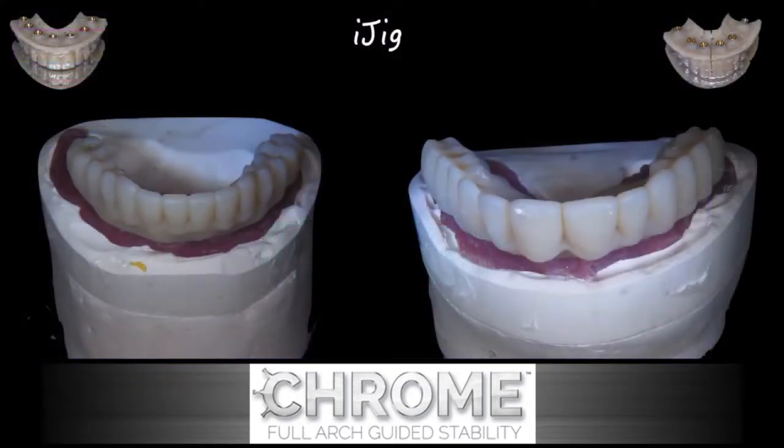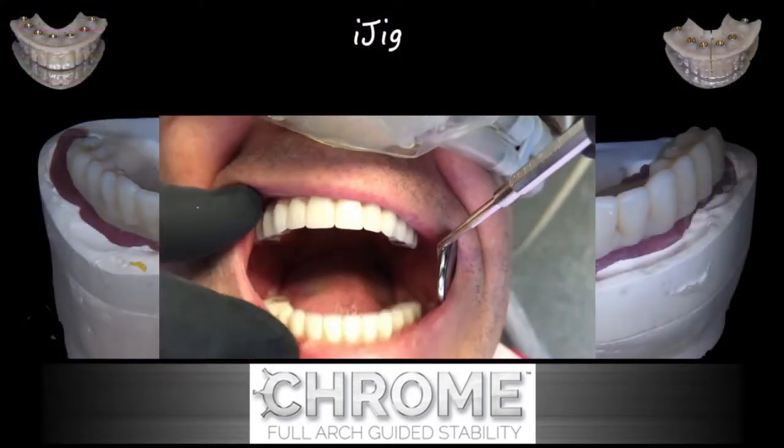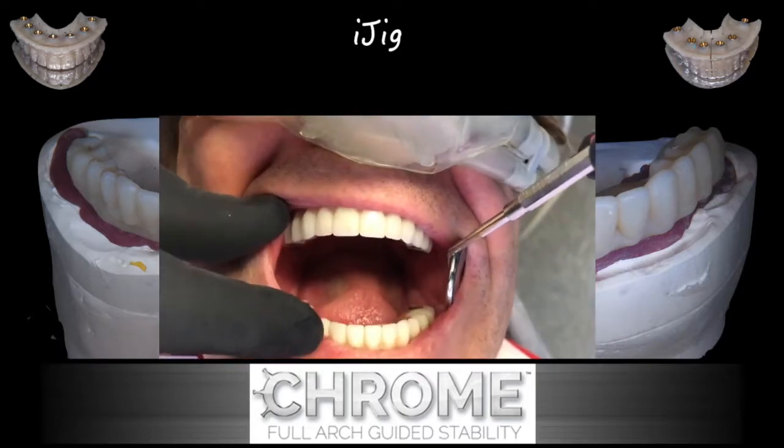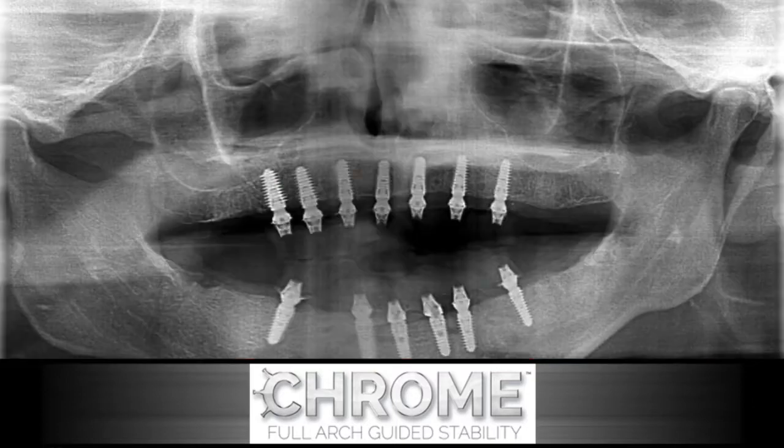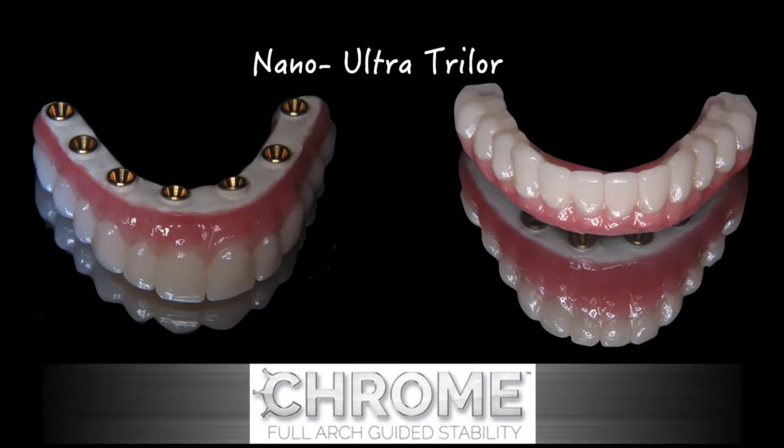As each of these arches is completed, you can visualize the bite relationship — it appears to be right on the money. Here are the multi-unit abutments in place in the maxilla and mandible. You can even see how the fixation pin areas that were more visible in the panoramic radiographs are now filling in with bone. This happens to be a nano-Ultra Trilor material for this particular case.